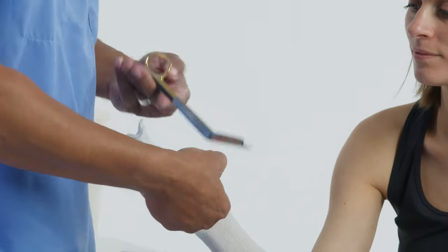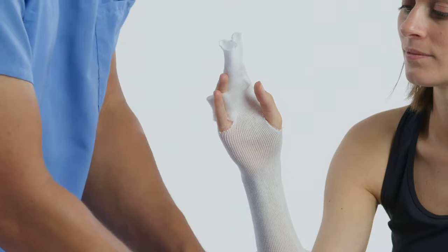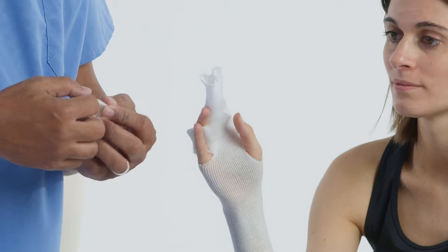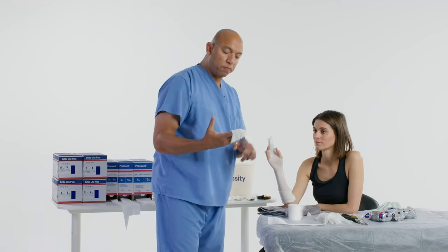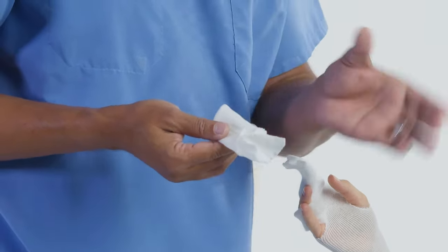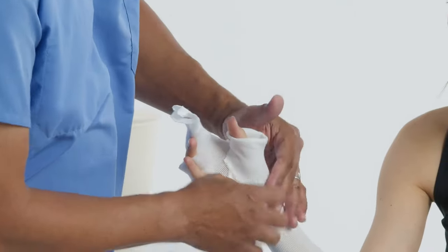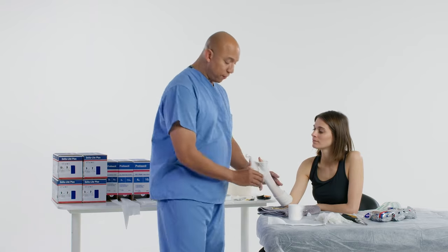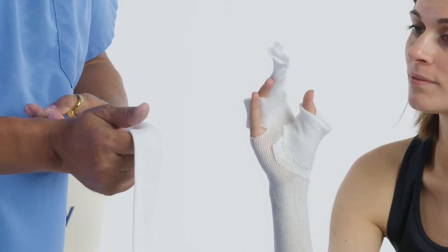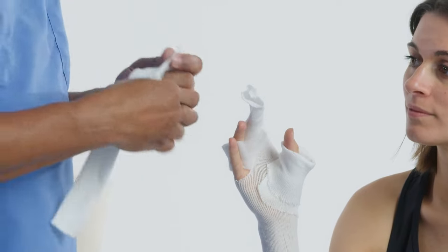Now let's cut a hole for the thumb and put something on the thumb. There are different ways you can apply stockinette to the thumb — I'm doing a simpler way right now, just making a little slit. This slit will be facing toward the index finger. You can use a one inch or two inch, it's your preference. Then let's put stockinette on the fingers involved in the cast — make a little slit there, and the slit goes between the fingers.